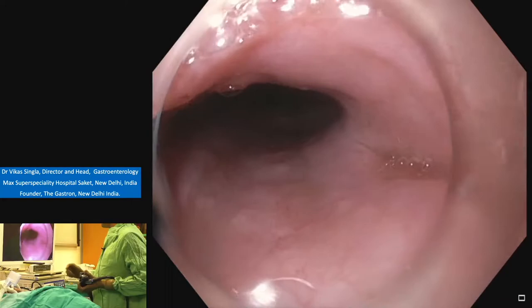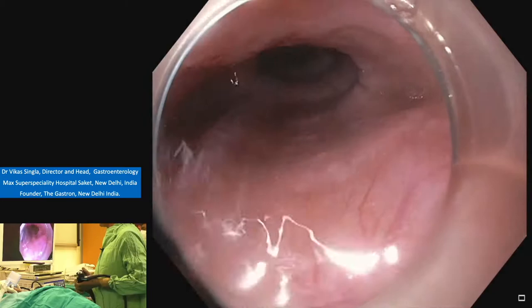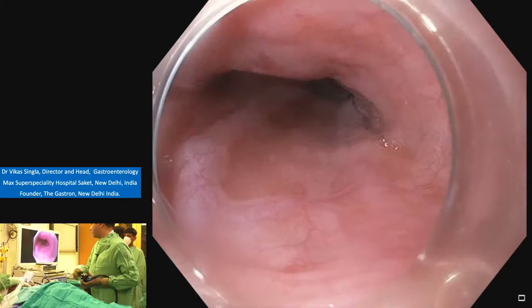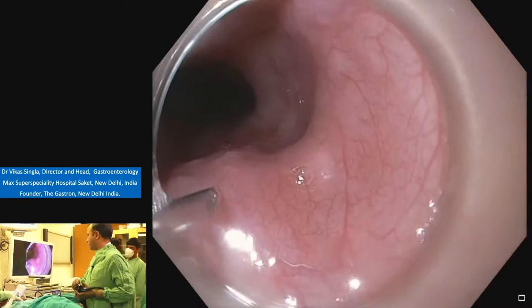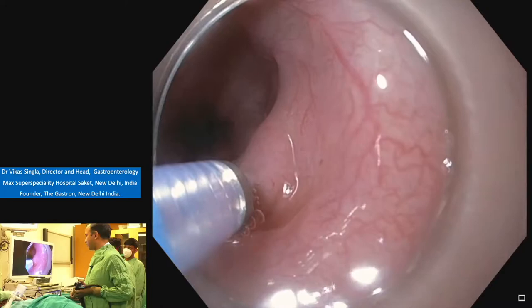The first step is the injection. We'll inject on the right side of the spine. The needle should be out, then we go inside. The area should be clean. We can see the vessel through the mucosa. It's a clean mucosa. First we go inside and then we start pulling back the needle and injecting at the same time. And that's it.